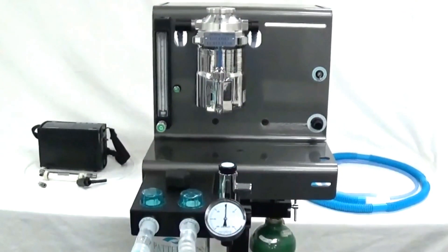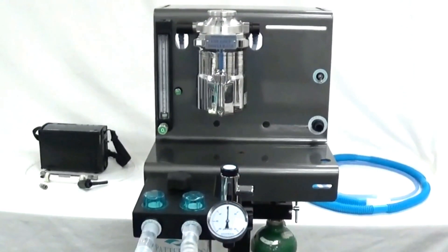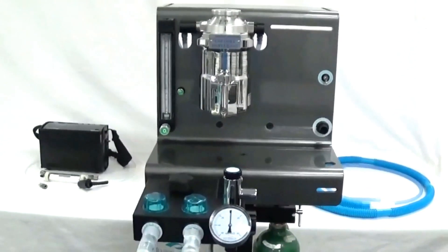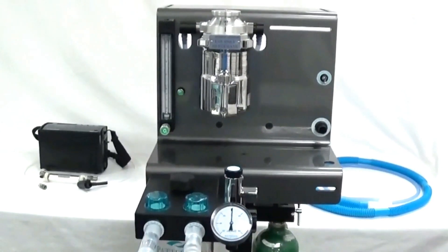This video demonstrates how to verify the output of an anesthetic vaporizer using the Riken Fi21 gas analyzer. We've set up a Versa 2 anesthesia machine with a TEC3EX vaporizer.